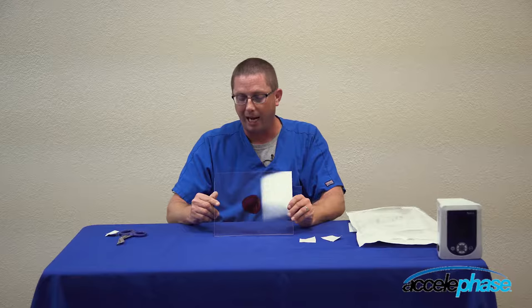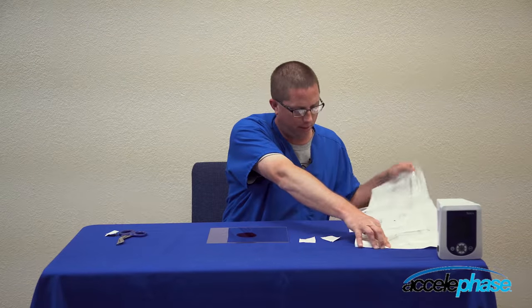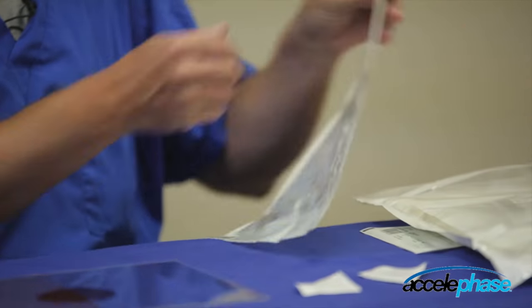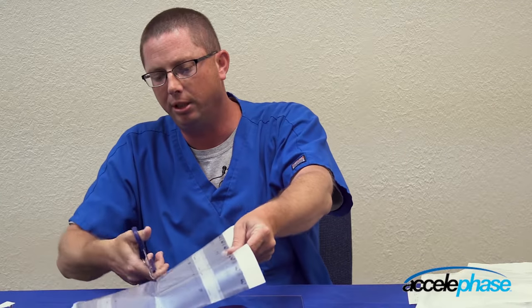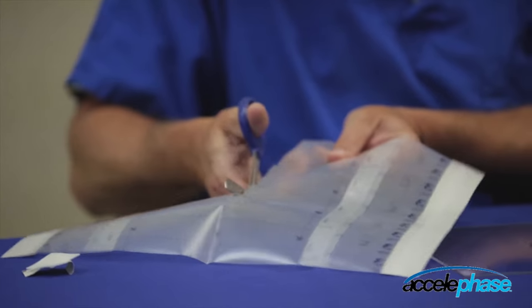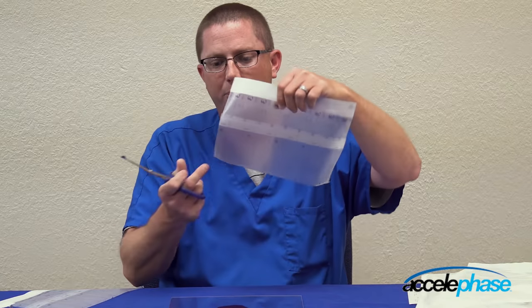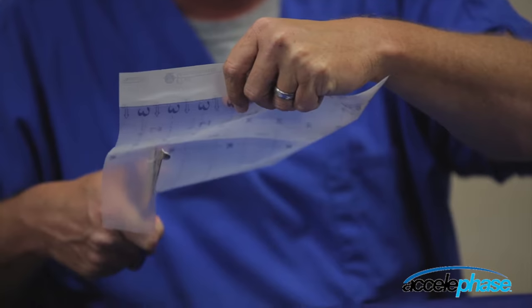So the first item after skin prepping would be to take your drape, remove it from the package. Your drape is an 8 by 10 sheet — cut the drape in half. Each line represents one inch, so you need to cut three to four one-inch strips.